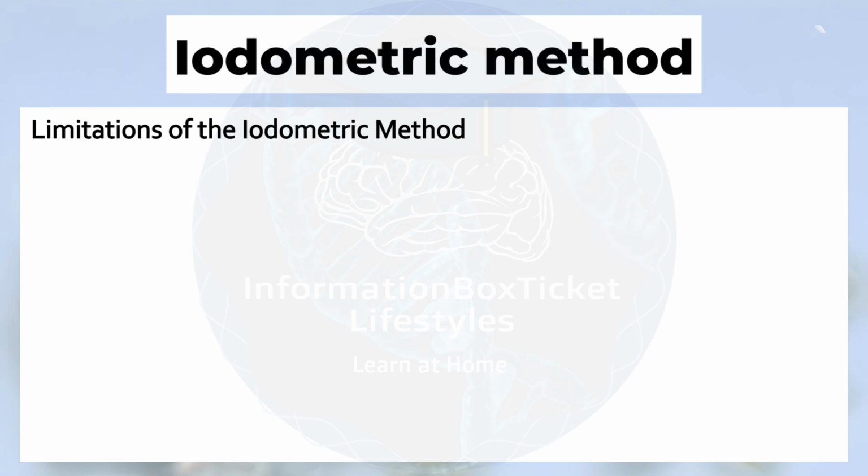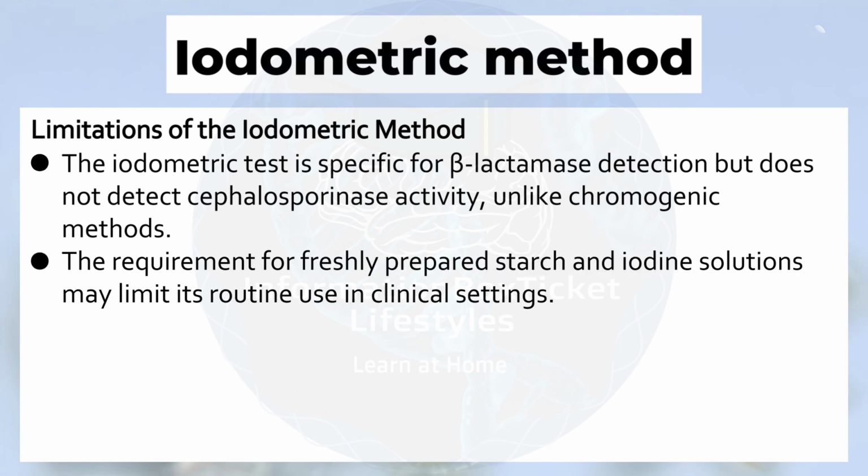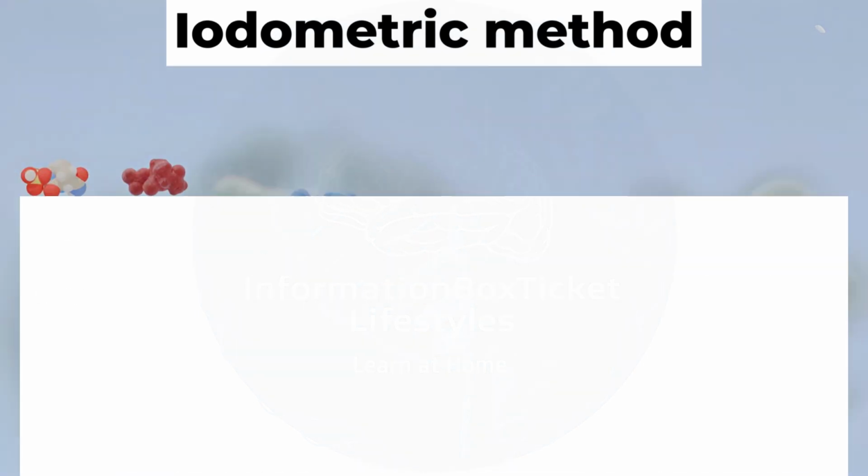Limitations of the iodometric method. The iodometric test is specific for beta-lactamase detection, but does not detect cephalosporinase activity, unlike chromogenic methods. The requirement for freshly prepared starch and iodine solutions may limit its routine use in clinical settings.